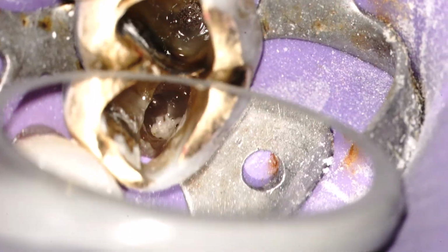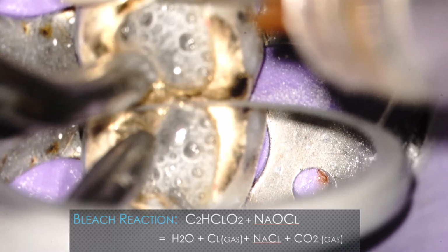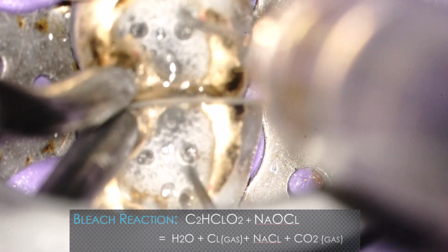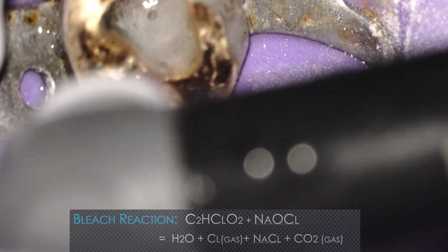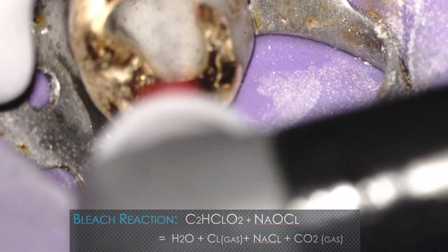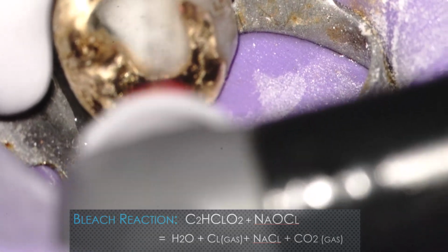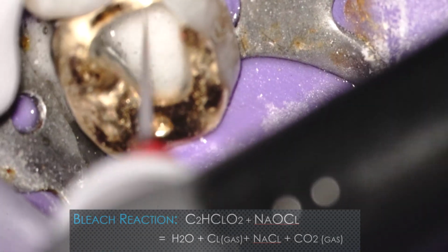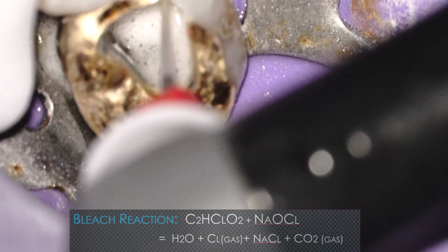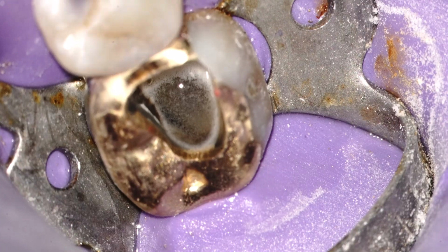I am now adding bleach to the TCA in the canal system, which creates a reaction producing water, chlorine gas, salt, and carbon dioxide gas. The chlorine gas presumably improves the debridement, as a gas has more diffusion than a liquid. The EndoActivator is used to agitate the liquid and provide better penetration of the fluid.